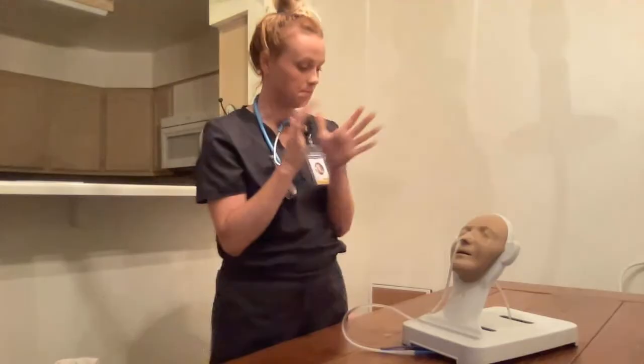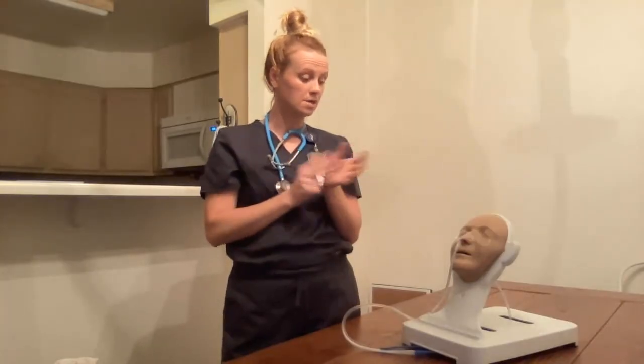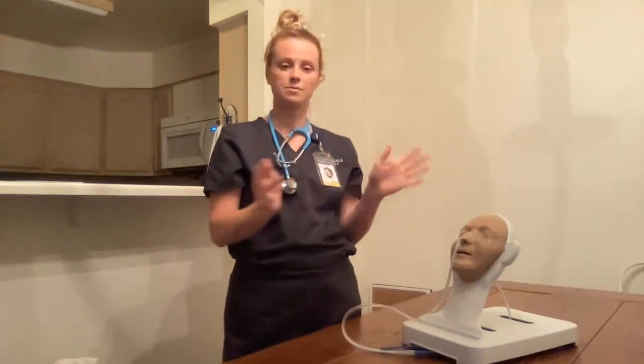When documenting the NG tube insertion, I want to document the procedure, any care provided, any assessments I did, and how my patient responded to the procedure.